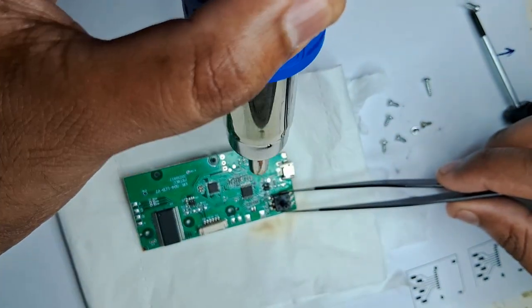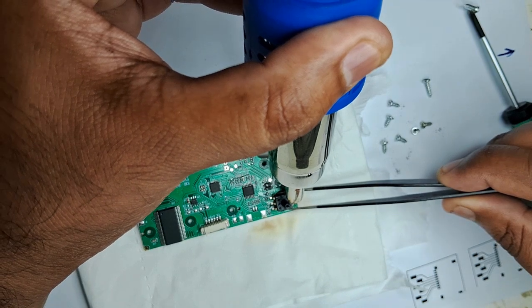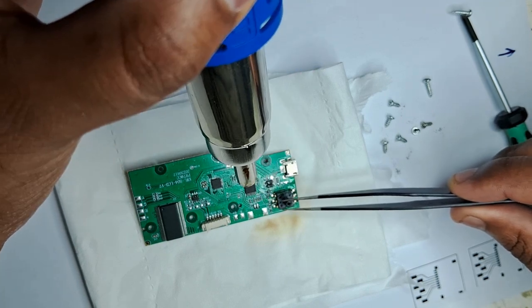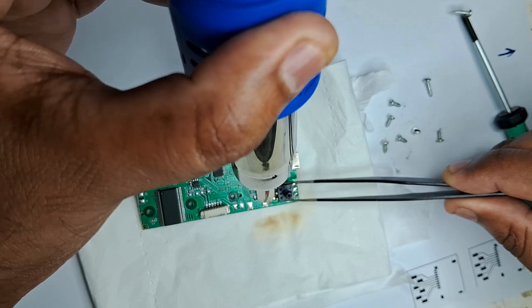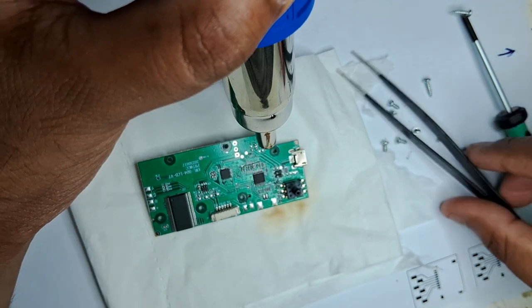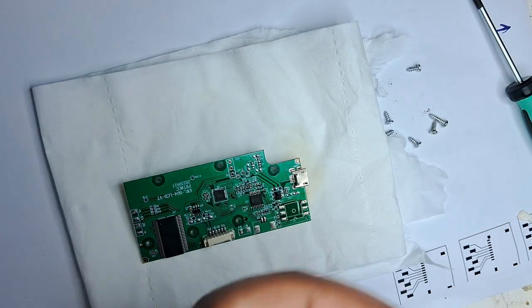We are trying to remove this guy out. Okay, so it will take a little extra time. Temperature is a bit more. Okay, so that's why things are not working properly. So what we are going to do is try some other method and try to remove this. So we have successfully removed this.